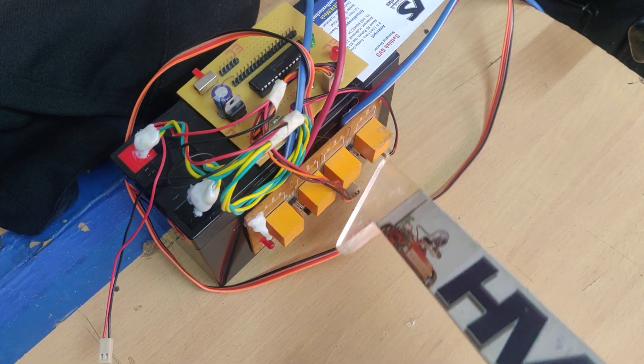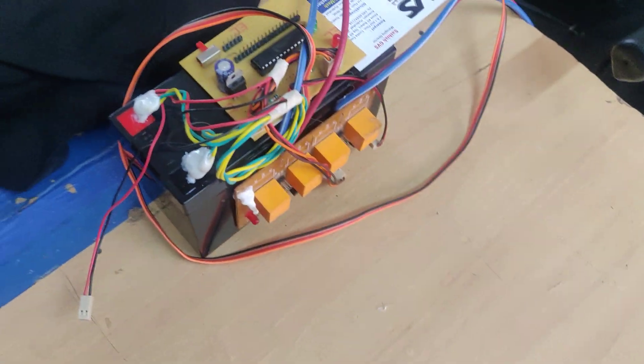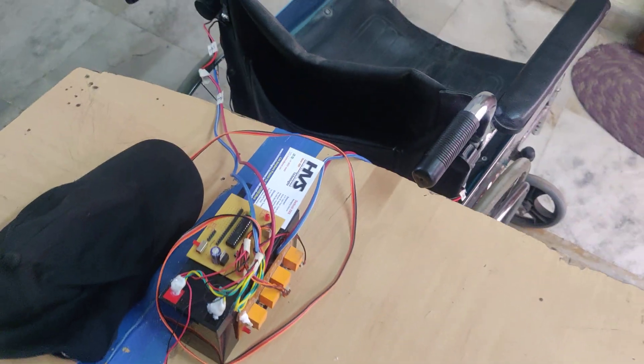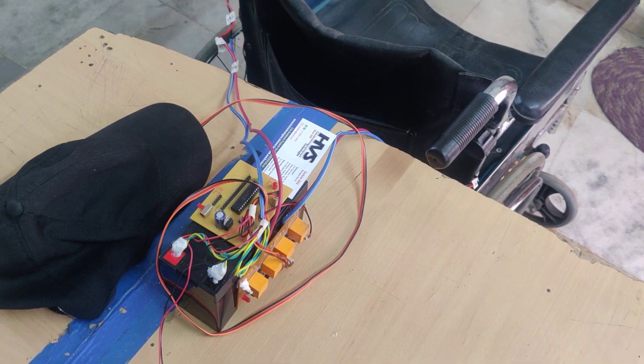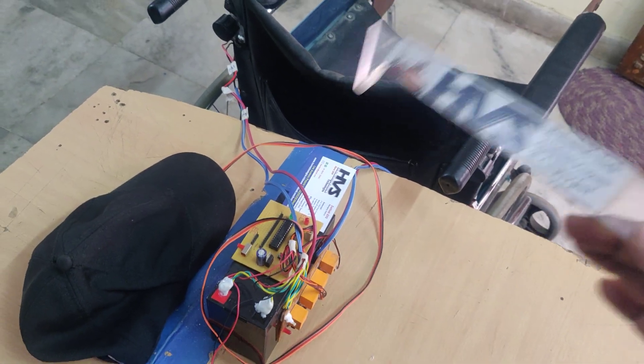The main purpose of these relays is that they act as switches. When we want to rotate the wheelchair in four directions, we need to control each motor in two directions. For forward motion, both motors should rotate in the forward direction.